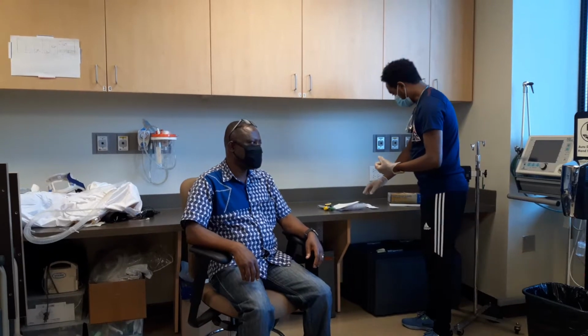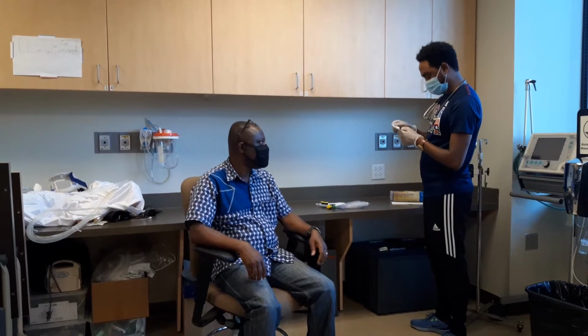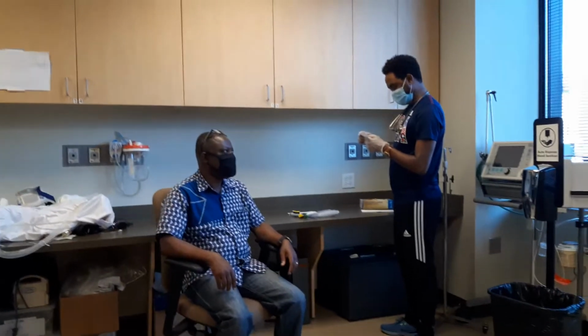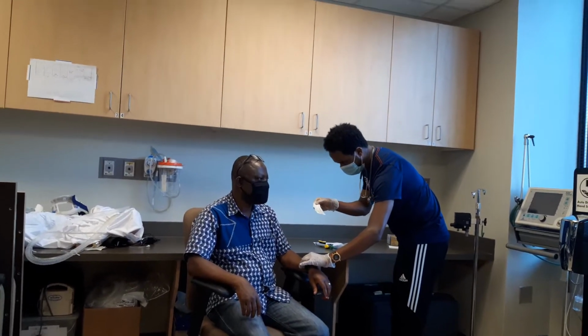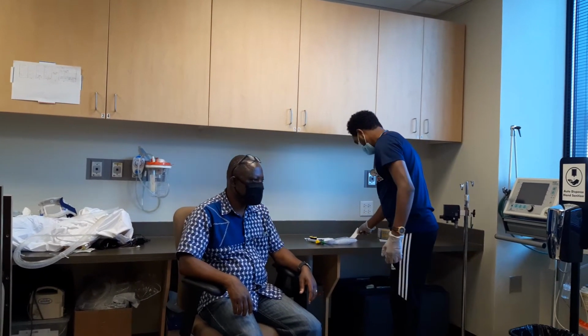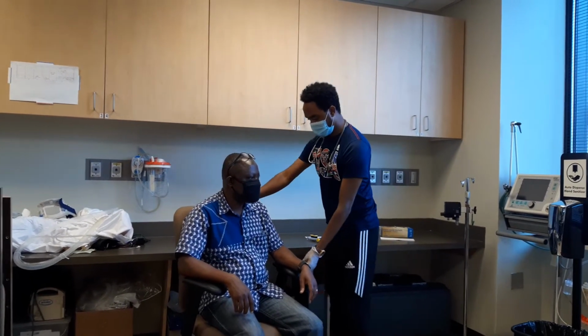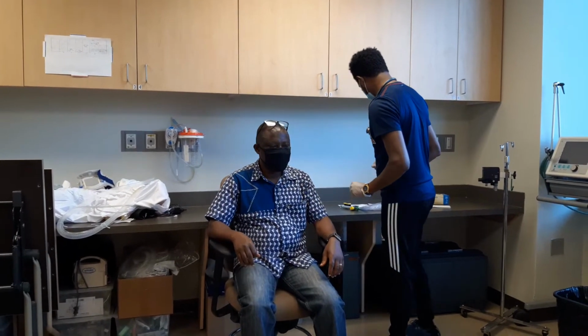Not really. All right. Let me confirm your name. Can I have your name? Charles Asante. Your date of birth? 02-02-70. Perfect. Let me match with your wristband. Perfectly match. All right, I'm going to arrange you in a sitting position. Is it a comfortable seat for you? Yes. Perfect.